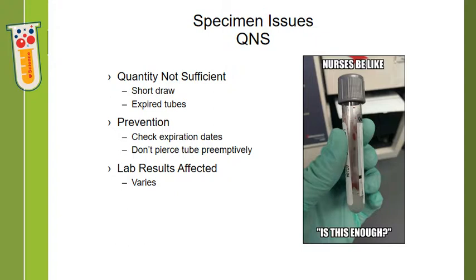QNS means quantity not sufficient — not enough sample to run the requested test. This can happen if it is a short draw or a really difficult draw. If the tubes are expired, they may not have adequate vacuum left to draw the correct amount of blood. To prevent this, always check your expiration dates on your tubes and all of your supplies. Don't pierce the top of the tube until you are ready, and don't pop the top off if you intend to use it as an evacuated tube, because it releases the vacuum. Generally you are probably not going to get results on QNS specimens and will have to call for a redraw.